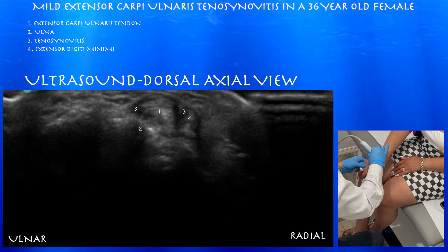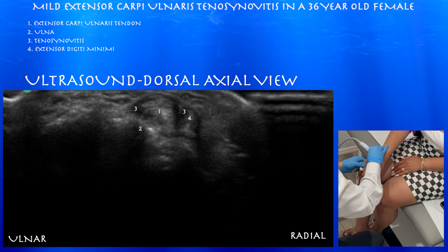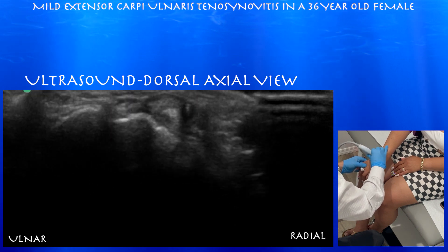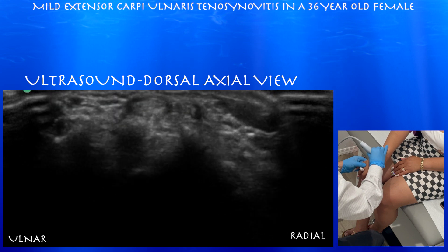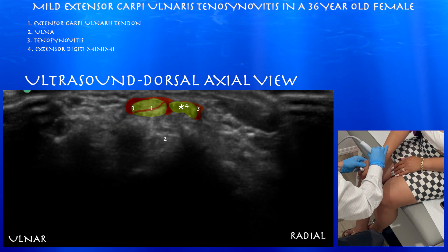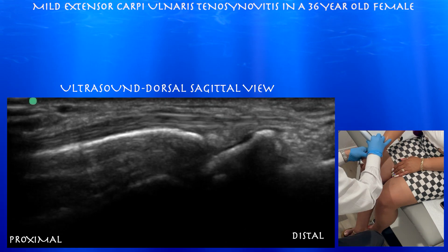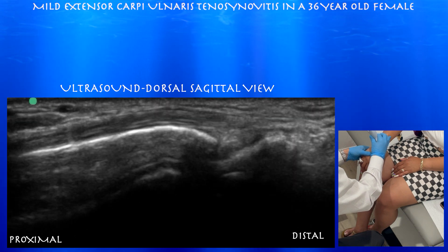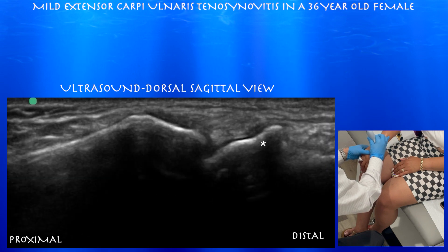Going a little bit distal, I am seeing some fluid around the extensor carpi ulnaris. Here you can see extensor digiti minimi as well, and there's a little bit of tenosynovitis around that tendon as well. Now we're looking at the extensor carpi ulnaris tendon in a sagittal plane, and you can also appreciate the triquetrum.